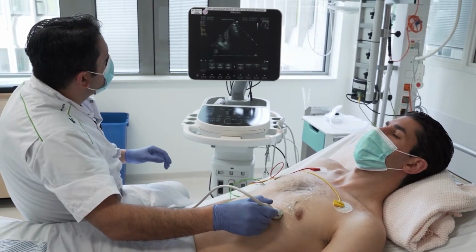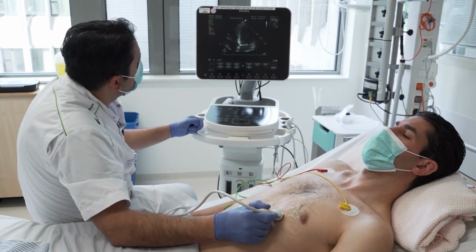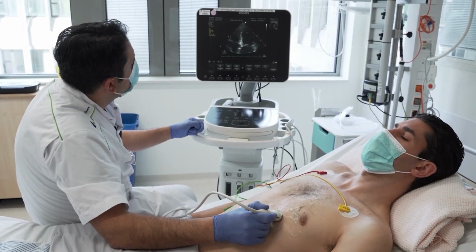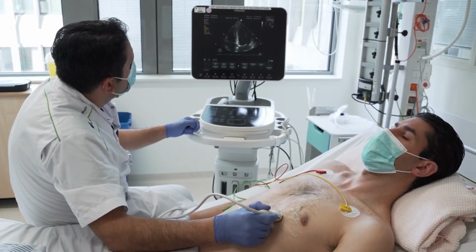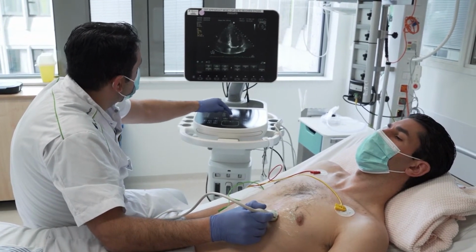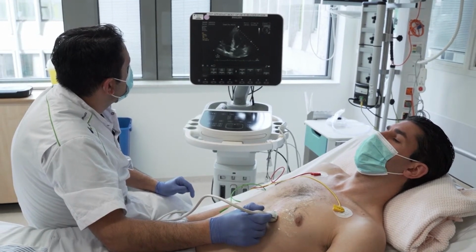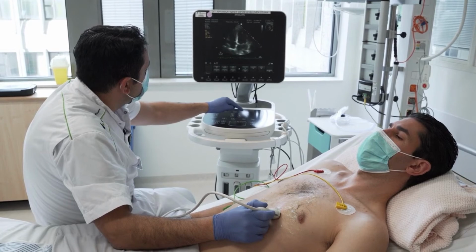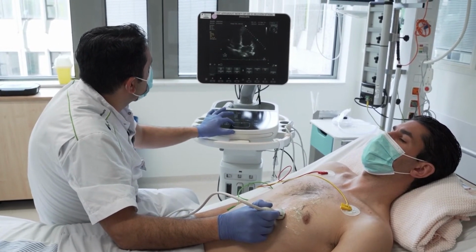And cardiologists will always put the patient on the left side because then the heart is nearer to the thorax. Of course, in trauma patients this is not feasible, but we are very lucky because we have found a very beautiful apical four-chamber view. So maybe you can show the different landmarks, Sakir.